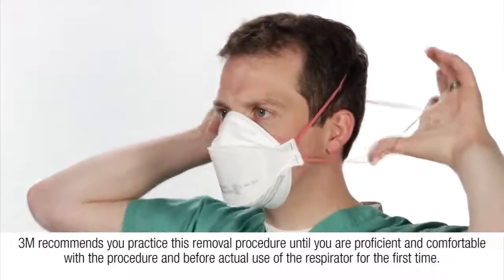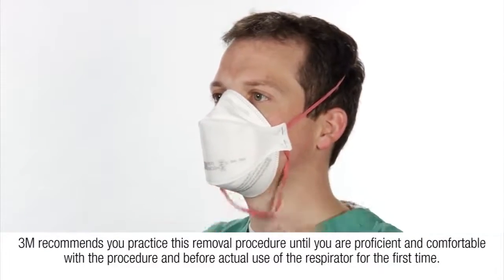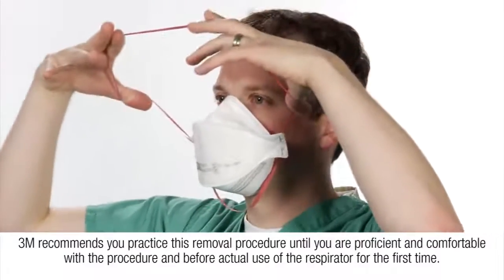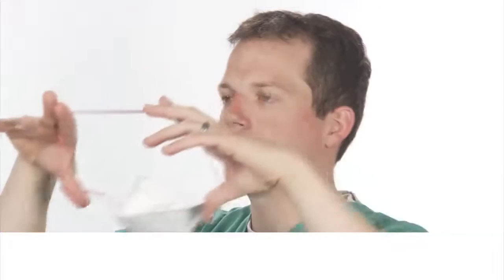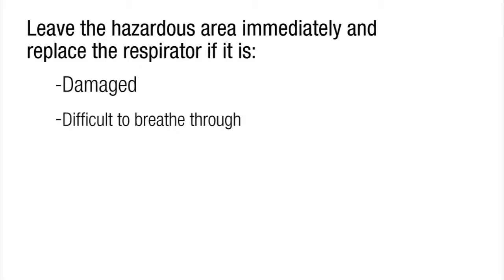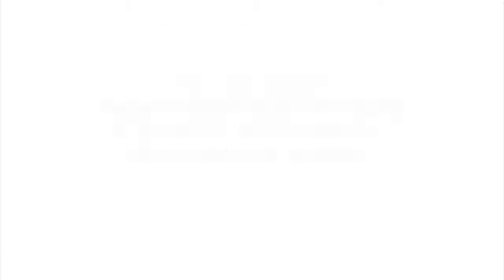3M recommends you practice this removal procedure until you are proficient and comfortable with the procedure and before actual use of the respirator for the first time. Leave the hazardous area immediately and replace the respirator if it is damaged, difficult to breathe through, or contaminated with blood or body fluids. Follow your facility's infection control policies and procedures for guidance on how frequently you should replace your respirator.